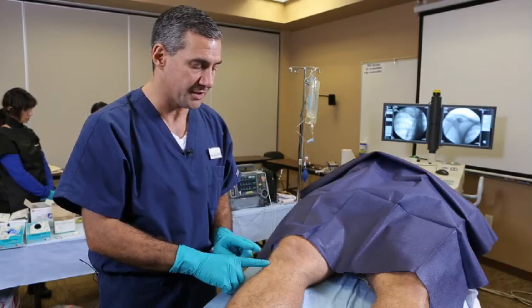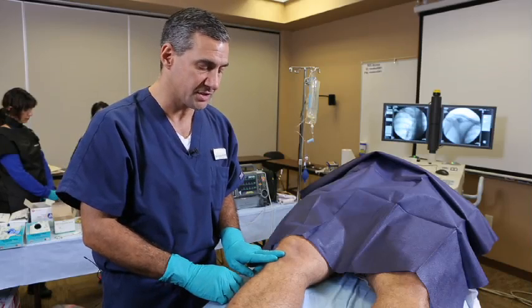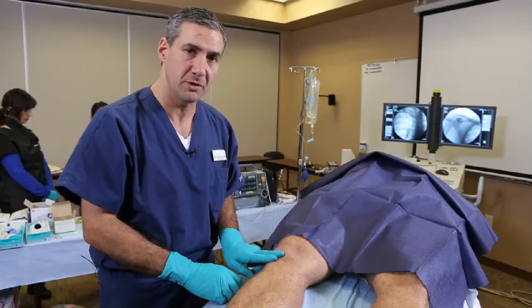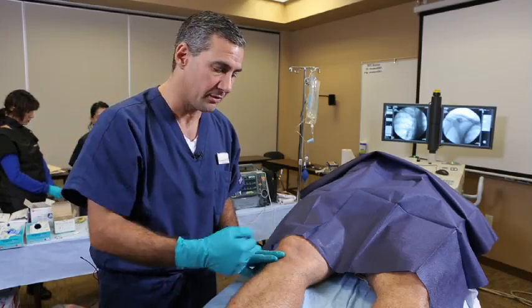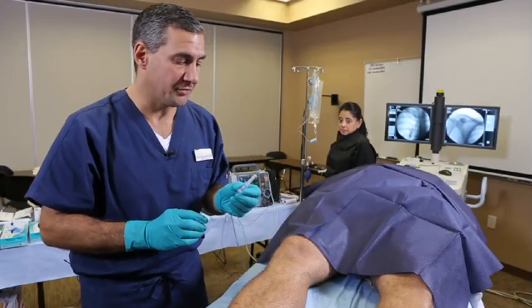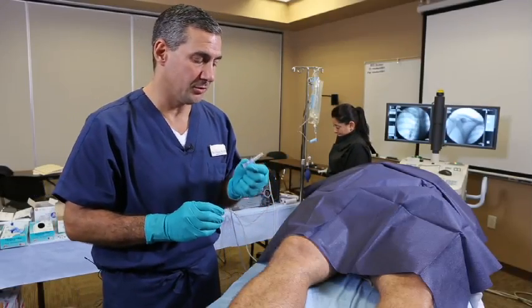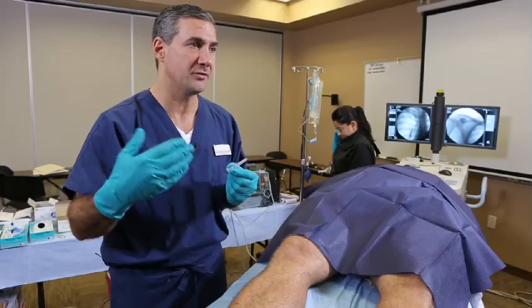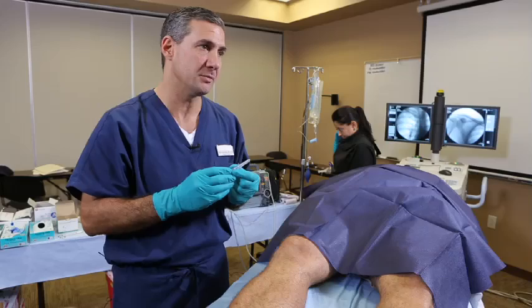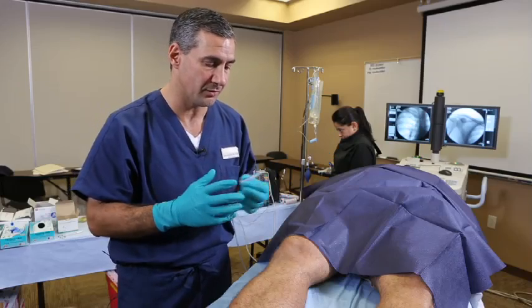The best way is to try to find the patella and go two fingerbreadths, which is approximately three centimeters below the inferior aspect of the patella, and two centimeters medial. So typically in most adults, the blue 25 millimeter needle will be the right needle of choice, but you have to account for soft tissue depth — you might have to step up to the yellow or 45 millimeter needle. So choose the right needle for the right patient.